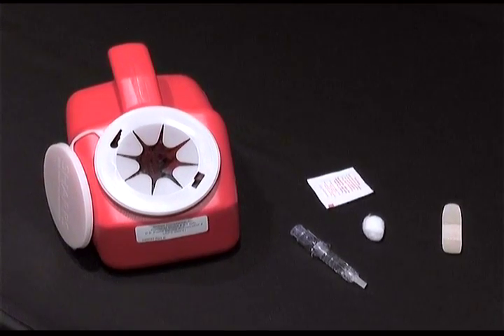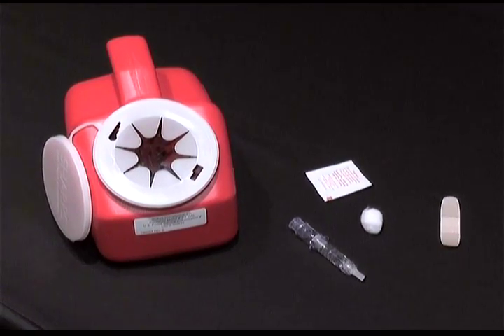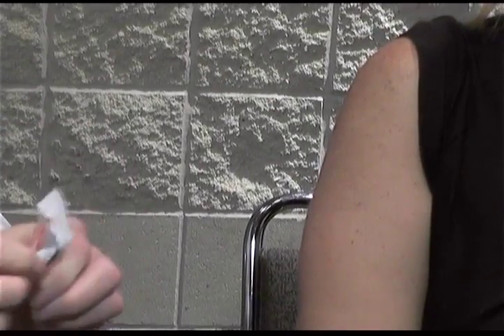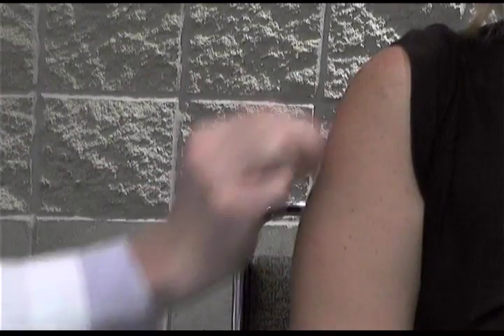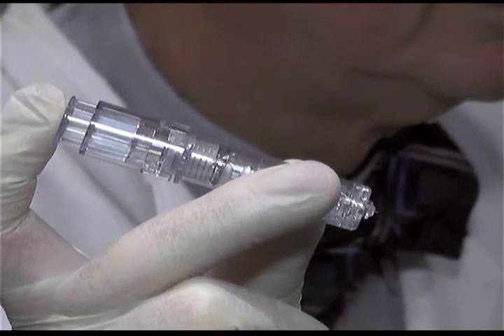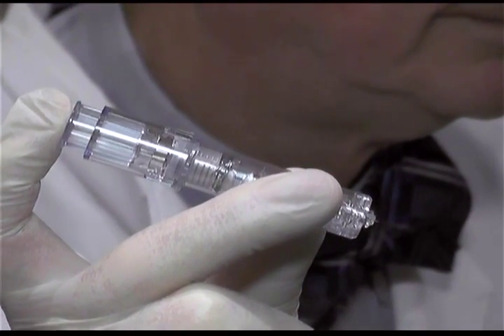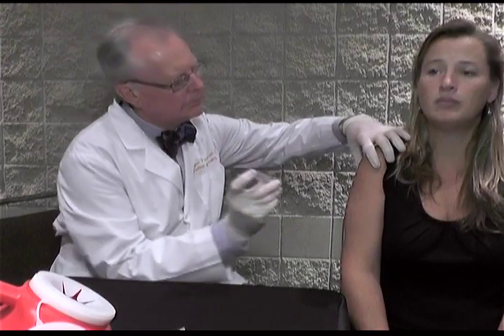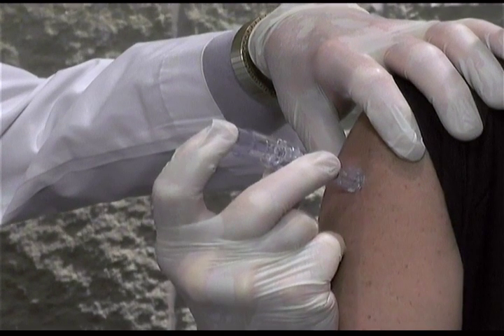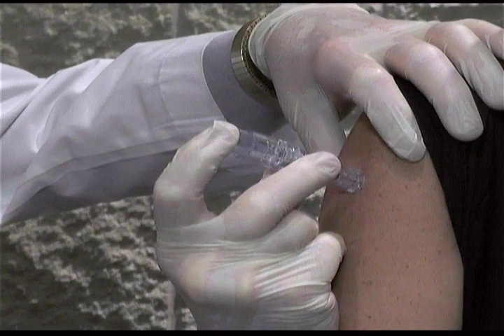The currently available intradermal influenza vaccine is distributed in a pre-filled syringe. Before you administer the vaccine, wipe the site with an alcohol swab to clean oils and dirt from the injection site and allow the alcohol to dry. When you are ready, gently shake the syringe, then remove the cap to expose the microneedle. Position the device between your thumb and middle finger on the finger grips, with your index finger free. With the patient's arm relaxed, place the device over the deltoid muscle with the needle perpendicular to the skin. With light pressure against the skin, insert the needle with a gentle motion — be careful not to push too hard.